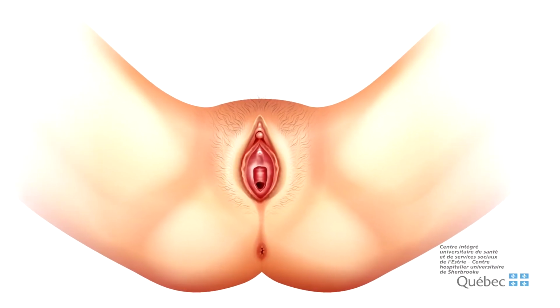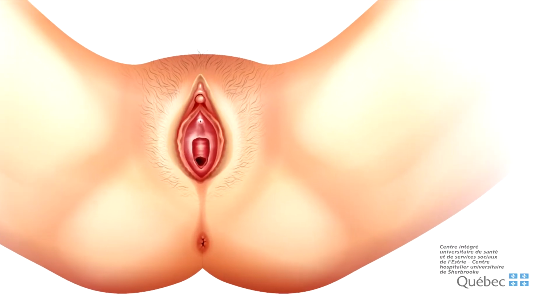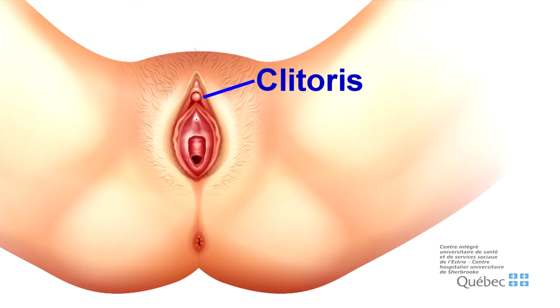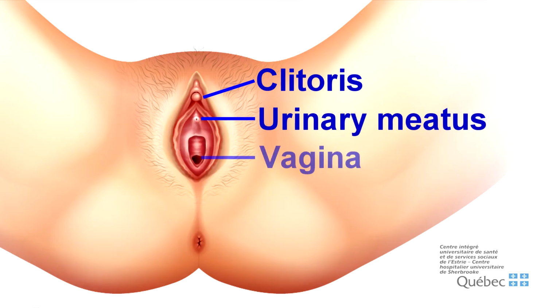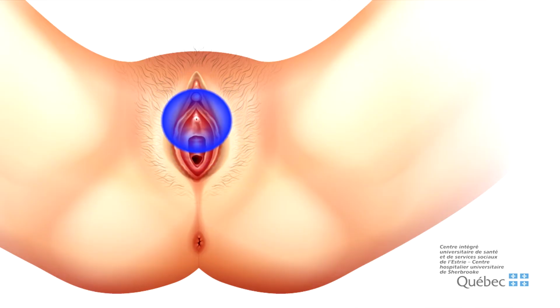That's why you have to learn to perform self-catheterization, which consists in inserting a small tube, the catheter, through the urinary meatus to your bladder. The urinary meatus is in the genital region. The genital region includes the clitoris, urinary meatus, vagina, and anus. The urinary meatus is located between the clitoris and the vagina. The catheter is inserted into this opening.